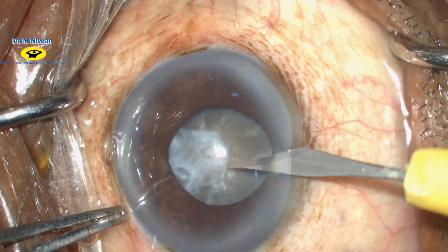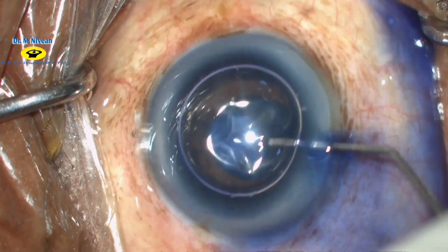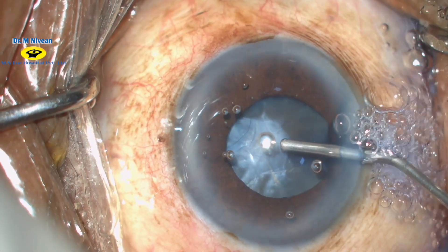Using a 15-degree sideport blade, the sideport is made. Under the air bubble, trypan blue dye is injected to stain the anterior capsule. Then viscoelastic device is injected to fill the anterior chamber.